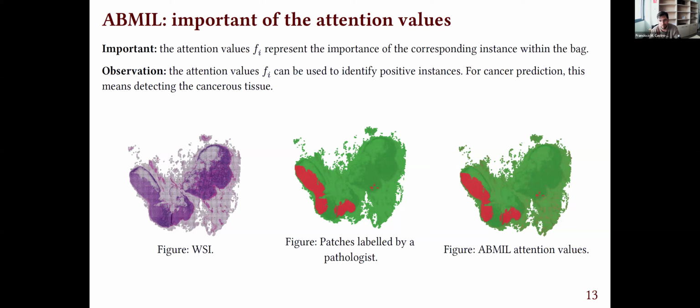Okay, here there is another question from Philip that says, how resilient is the MIL library for whole slide images that may have noise within their structure or have other perturbation due to poor data capture during staining, digitizing? How accurate is the classification with this noisy artifacts?